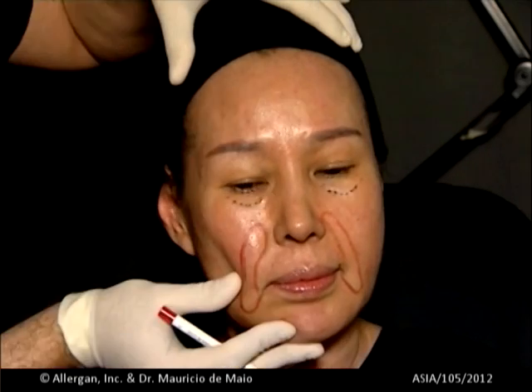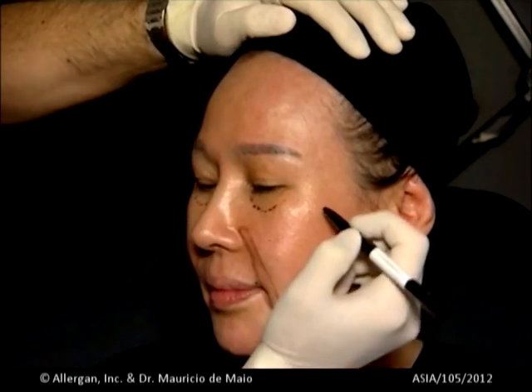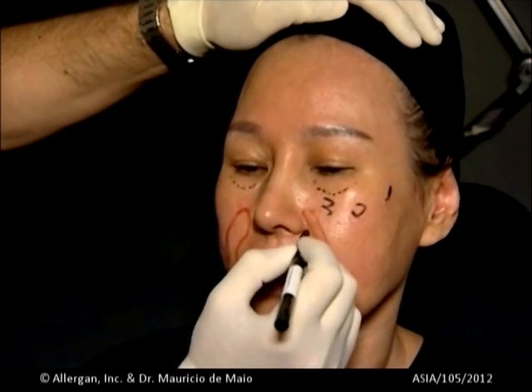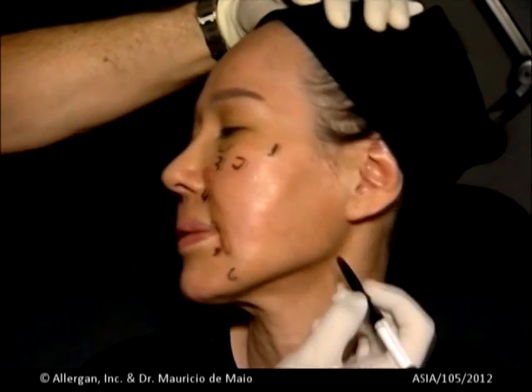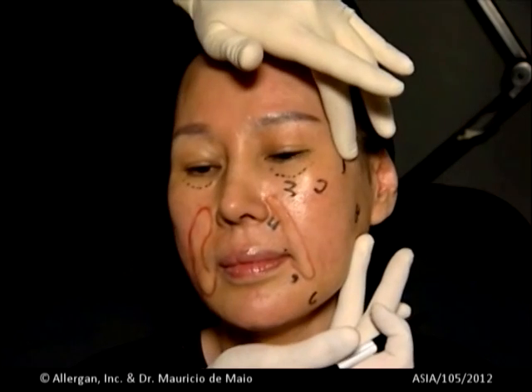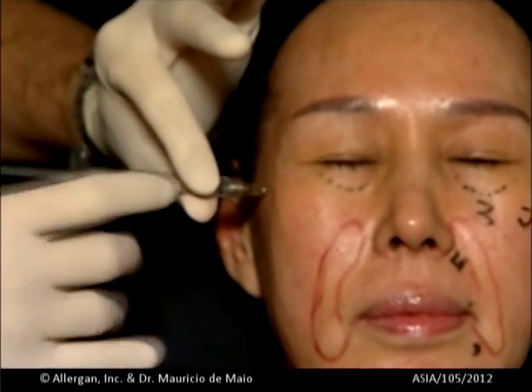Retract the skin, pre-test the degree of difficulty, and mark point number 1, 2, 3, 4, 5, 6, 7, and 8. Stretch out and proceed with the injection in point number 1.